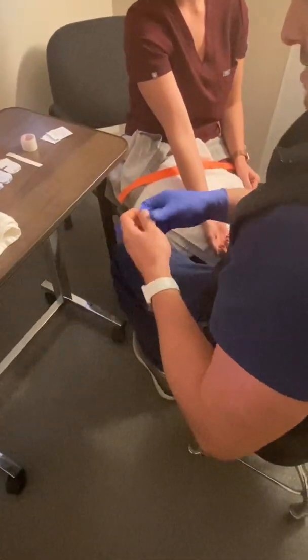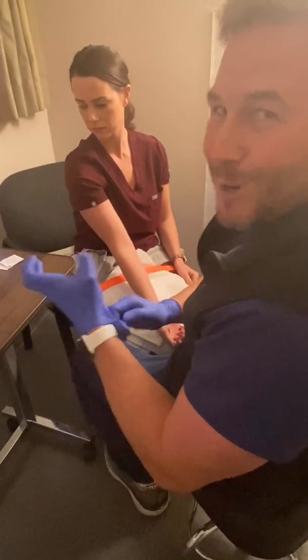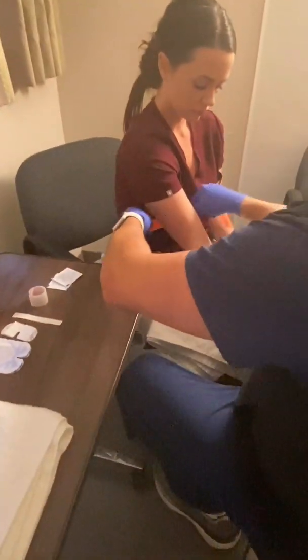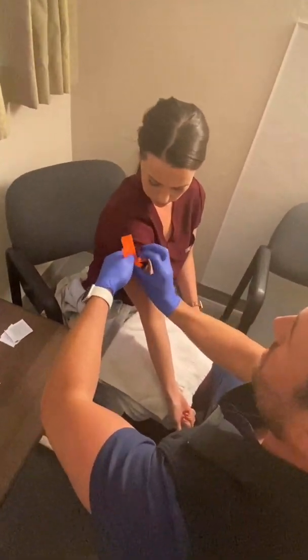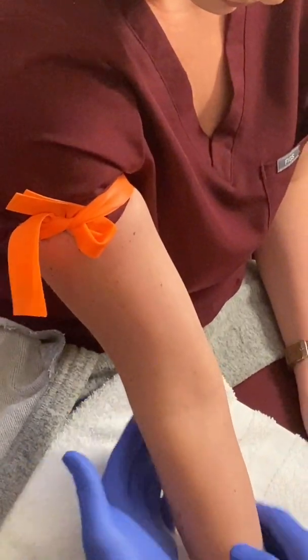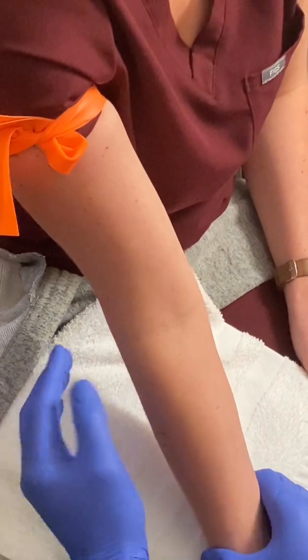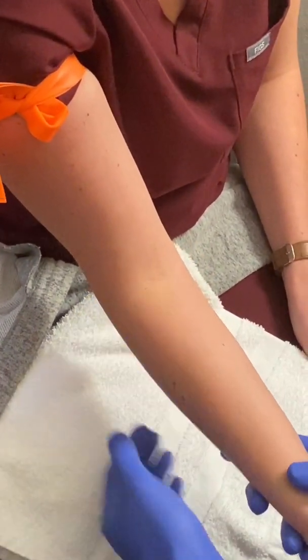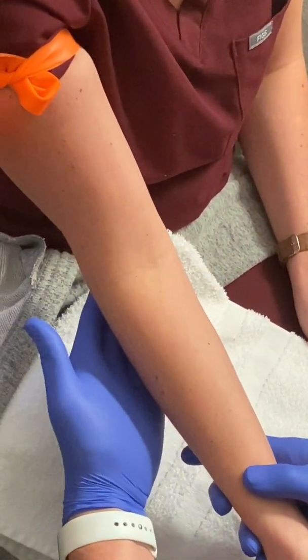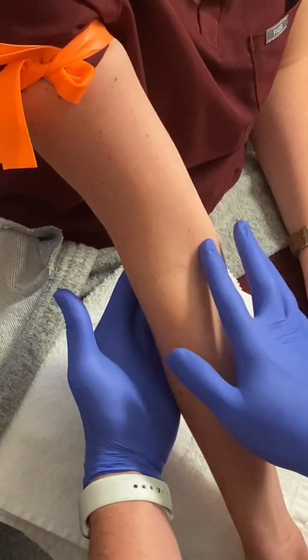So like always, being that you guys are nursing students and one day will be nurses, use universal precautions. All right. A good thing to do a lot of times if you're planning to go right here in the antecubital section of the arm, the midline of the arm, is that a lot of people have their arms bent. Get your hand behind it and hyperextend that arm. It will push up on that vein to get it to the surface.